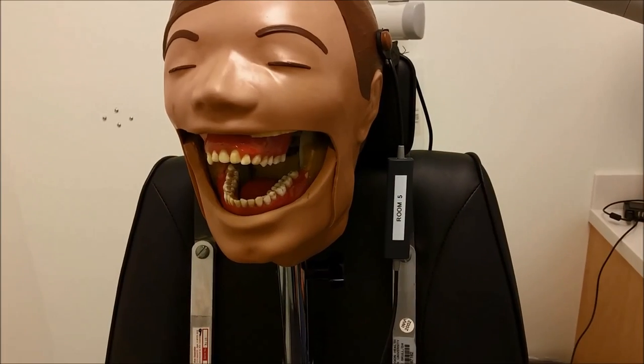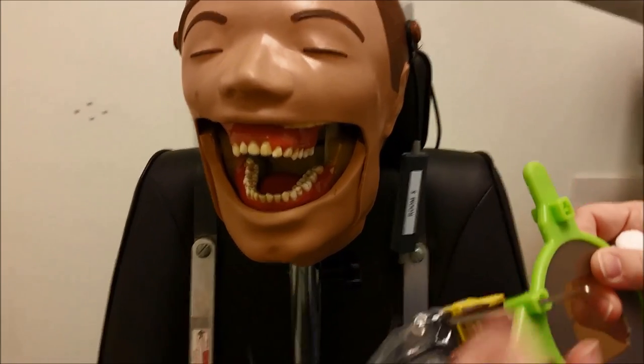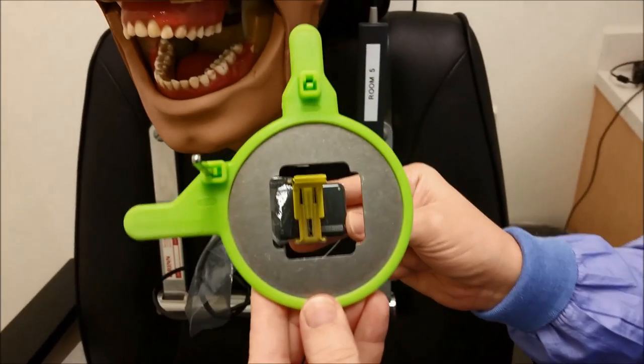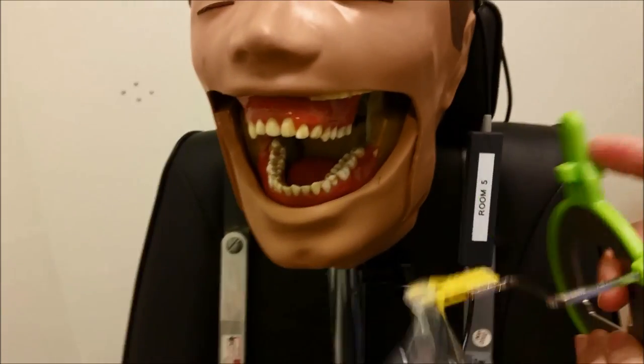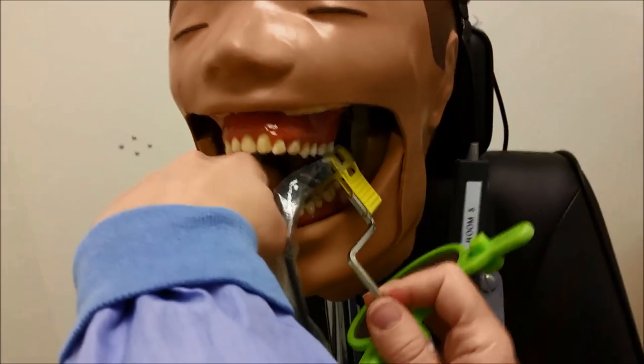Now we're going to move on to the mandibular premolar periapical. So we have our XEP instrument all set up and our sensor in the right place. We're going to push the tongue out of the way so we have room to get our sensor in.